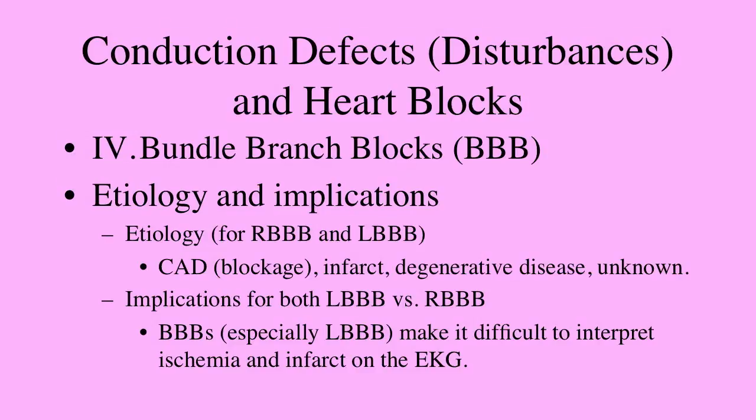Later in the course we'll look at a system for reading the EKG, but you would write or say left bundle branch block is present, therefore I cannot do any more interpretation of this EKG. It kind of stops the interpretation. Some major implications for an exercise science student is that the bundle branch blocks, especially left bundle branch block, make it difficult to interpret ischemia and infarct on the EKG.